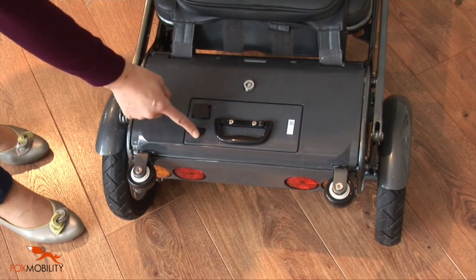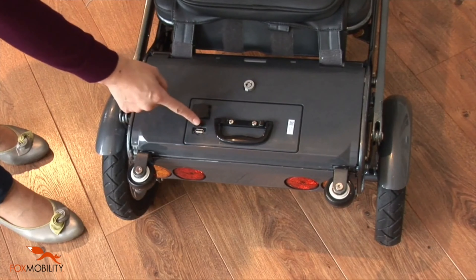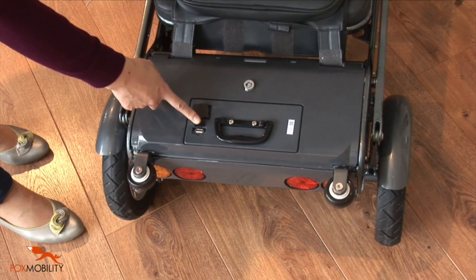As you enjoy your day out with the eFoldie, it can also be used as a super charging point to charge phones, Kindles, or other electronic devices.